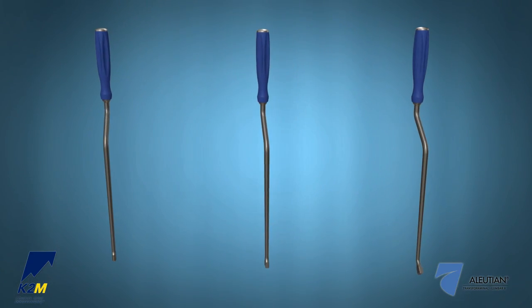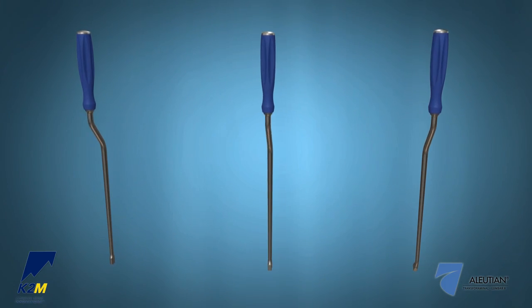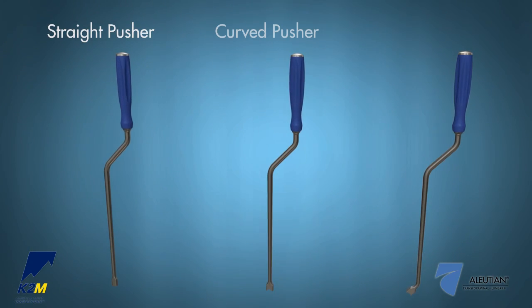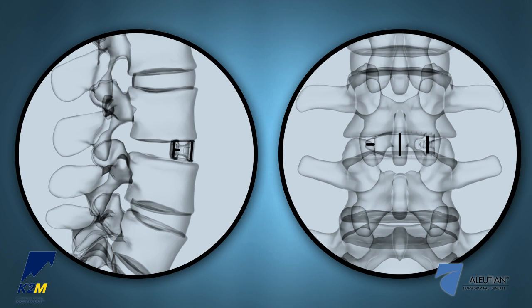A variety of pushers are also available to aid in final placement of the interbody. The pushers come in straight, curved, and angled options. Under ideal implant placement, the medial tantalum marker will be aligned with the spinous process in an anterior view, and the posterior markers will form a sideways T in a lateral view.